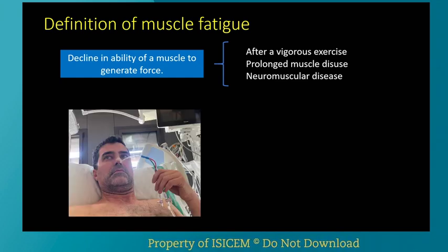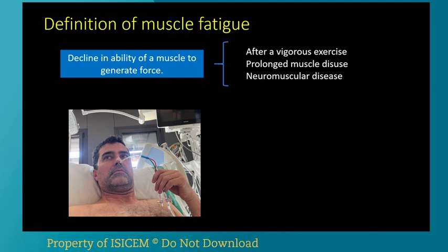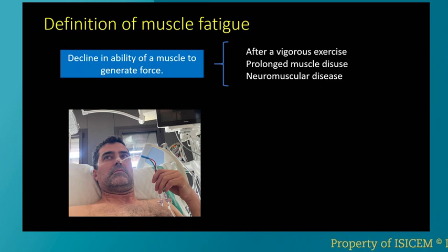And the way to measure the pressure is, as Jose said before, placing an esophageal balloon, which I can swear is not so comfortable, especially in patients who are not intubated or those who are awake. Every time you try to swallow and you have the catheter inside your stomach, it seems that it is the end of the world.